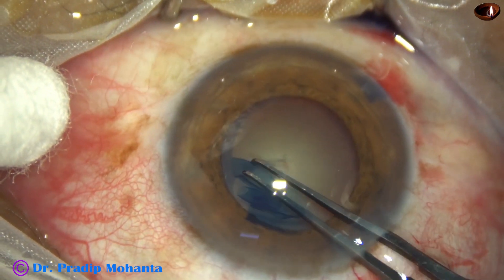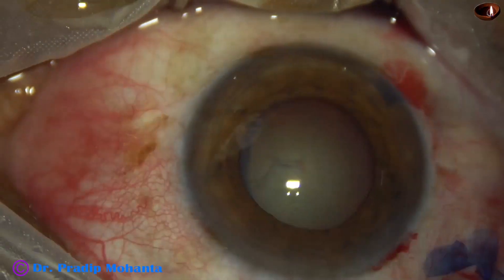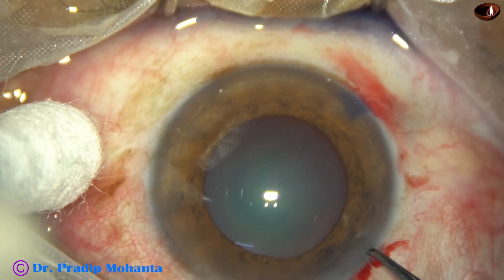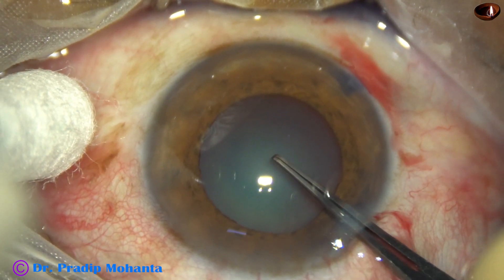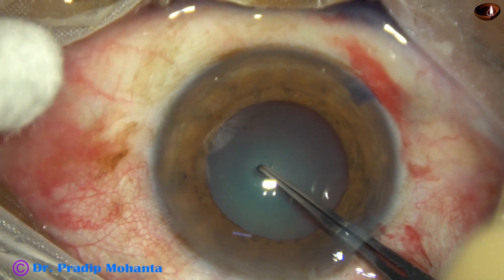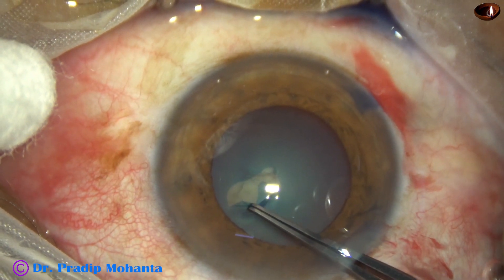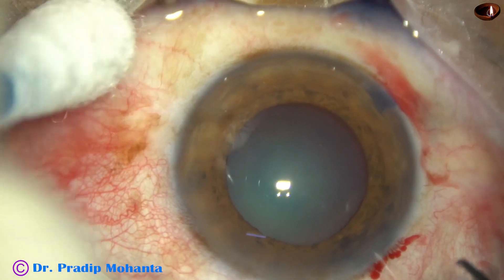Now let us see this in slow motion. The utrata forceps goes in and pierces the anterior capsule. This is one quarter of the real speed. It pierces the anterior capsule and goes towards 3 o'clock or 4 o'clock, rips apart the anterior capsule. One prong goes into the cleft, another one onto the anterior capsule, holds the capsule and starts.